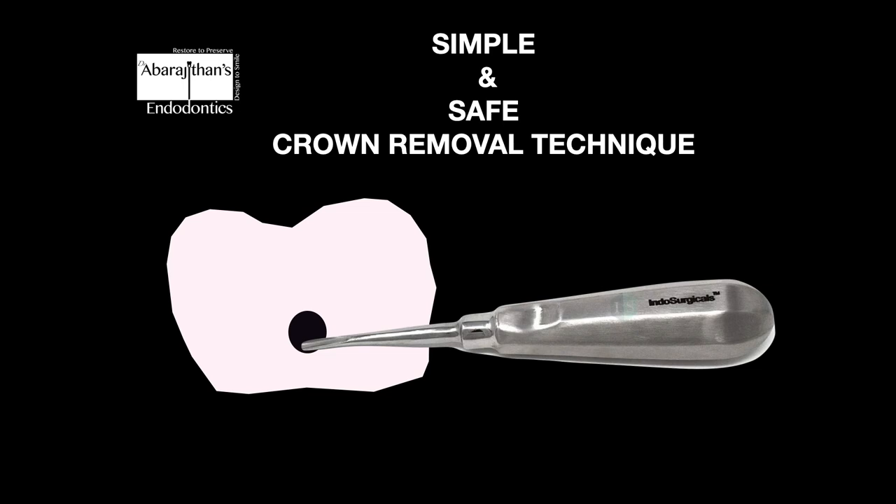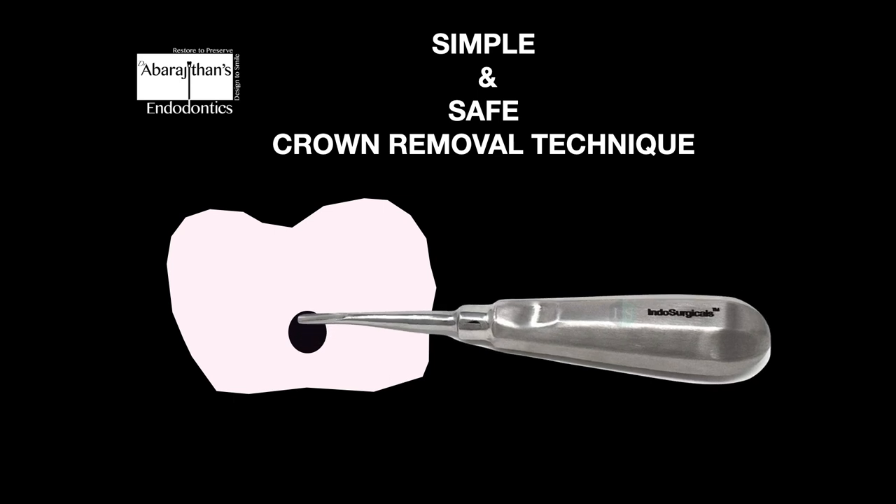This rotation produces levering forces which disengage the bond between the crown and the underlying cement and tooth structure, and safely removes the crown.